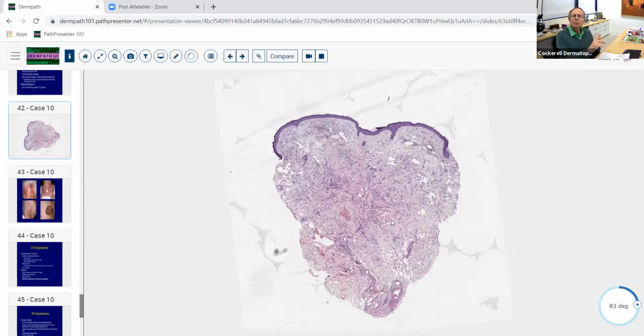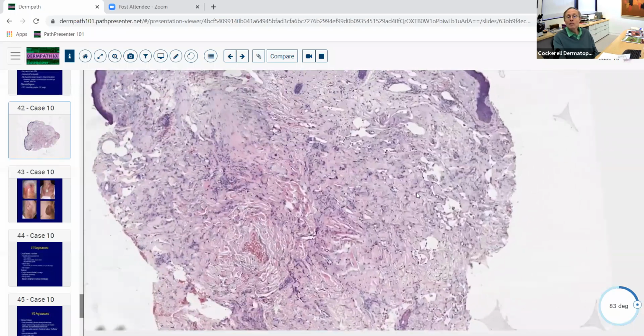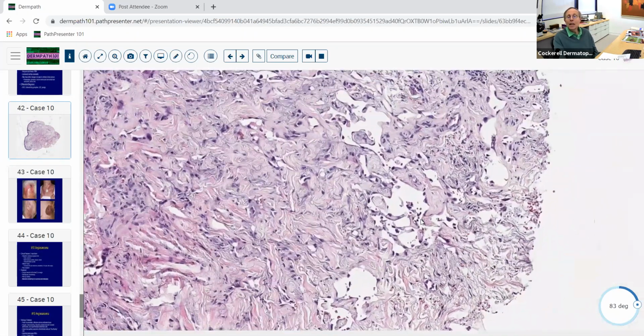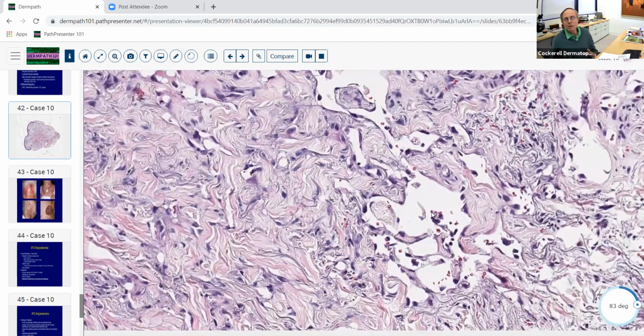So we've had Leishmania giving clear areas. We've had silicone giving clear areas. Well, maybe this one we've got something different giving clear areas. And yes, by goodness, look at this. We've got these vascular spaces that are giving clear areas. So blood vessels. Now, if there's a lot of blood vessels and they have a lot of red cells, they're not going to look clear.